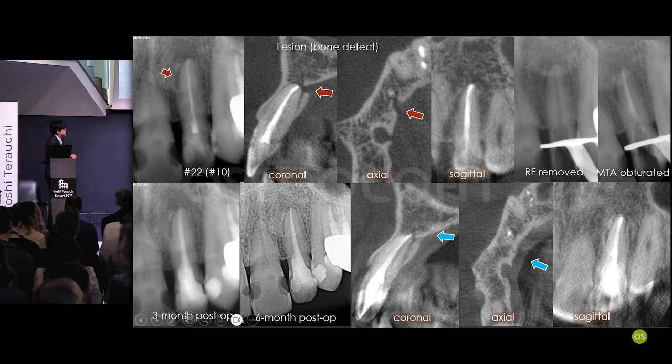And this is 3 months post-op. This is 3 months post-op. You see the bone. You see the defect before the treatment. And this is 6 months post-op, showing nice periapical healing. Look at the bone.